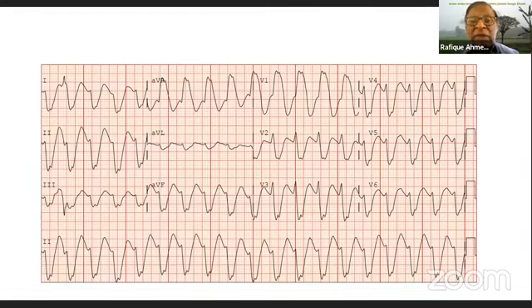And the other thing Hafiz mentioned is very interesting, the relation between the level of potassium and the EKG change. Even though there is a relation, I think the acidosis plays a significant role. I have seen an ugly looking ECG with potassium of 5.6, which normally you would see with a potassium level of 10. But having the suspicion of hyperkalemia is very important, because if we don't fix the hyperkalemia, you can keep trying all kinds of things, but nothing will work.